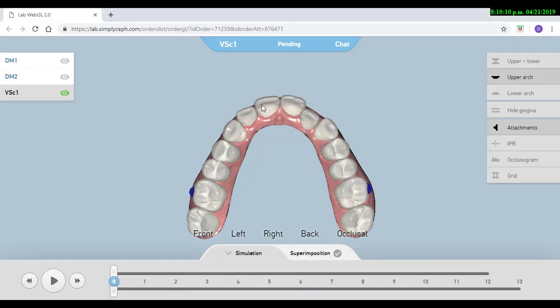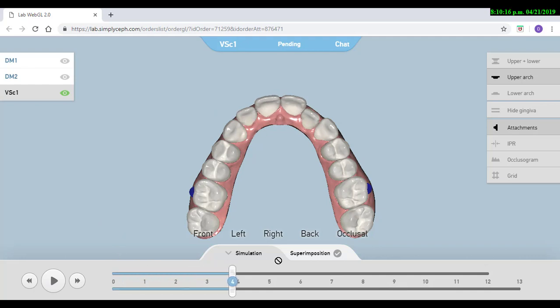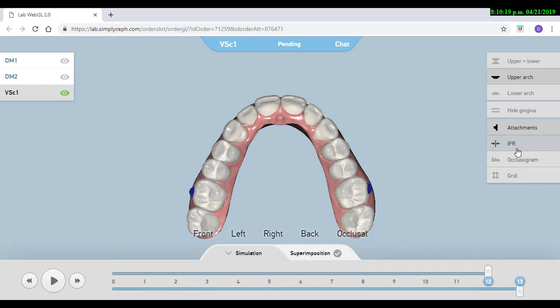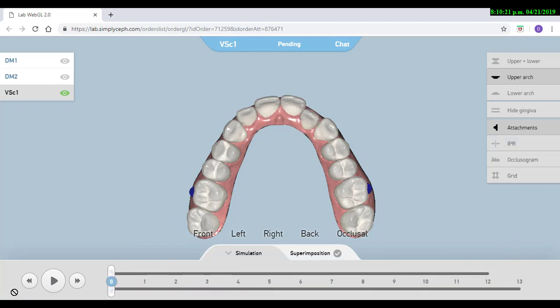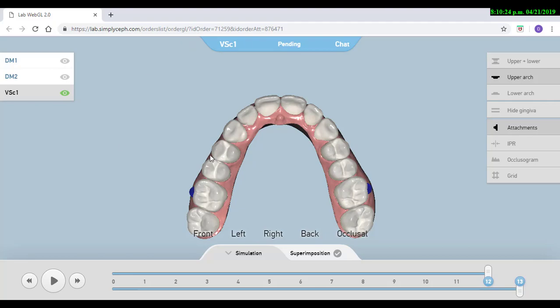In this case, as you can see, we are creating that space for these two laterals by making expansion movements. We didn't perform IPR and we didn't procline too much. It was mainly expansion to create that space.